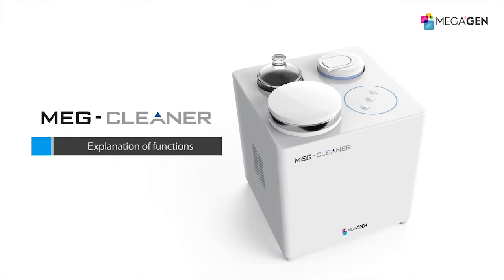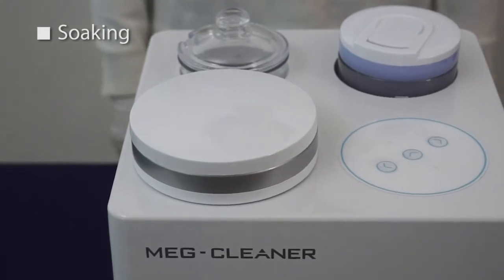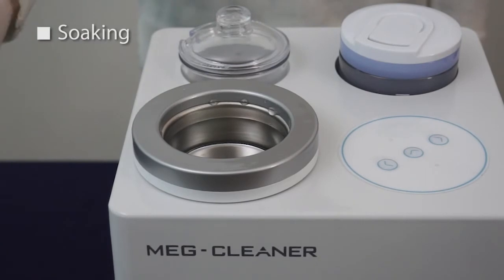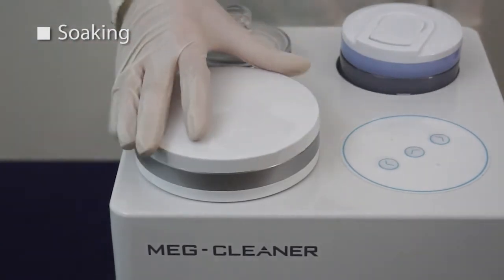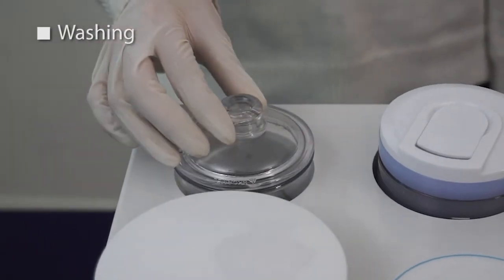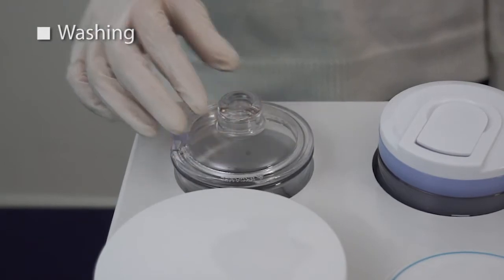Explanation of functions. Using the soaking jar function more effectively removes contaminants by using the 40 kilohertz high-performing ultrasonic transducer. Using the washing jar function can have a powerful cleansing and polishing effect on the object by making the high-speed pins rotate.